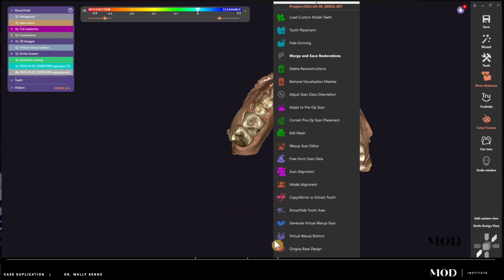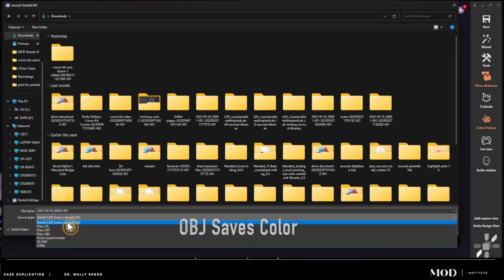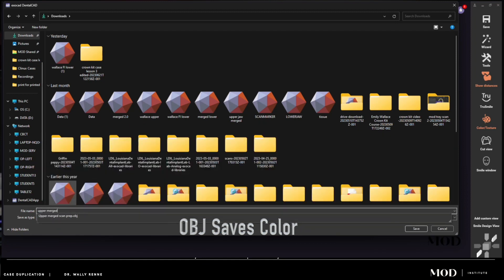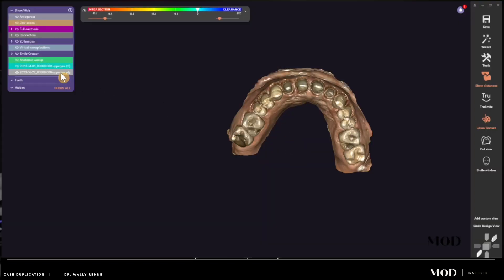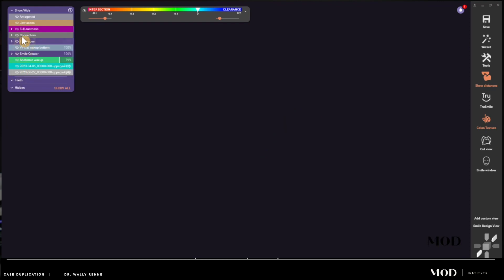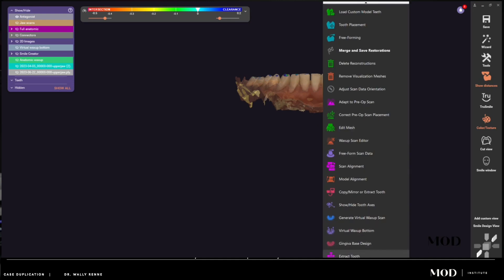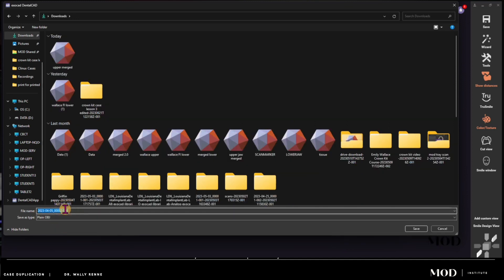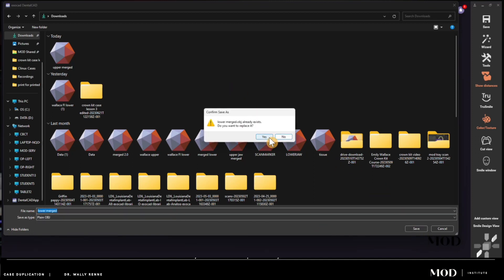Now I need to export my upper model. I'll right-click and go to Save Scene As, saving it as an OBJ — which is the color file — and I'll call it 'merged upper' so I know this is merged to my preoperative wax-up. Then I'll turn on my lower jaw and save it — that's my original lower scan from the mock-up — and I'll call that 'merged lower,' saving it as an OBJ or STL file.